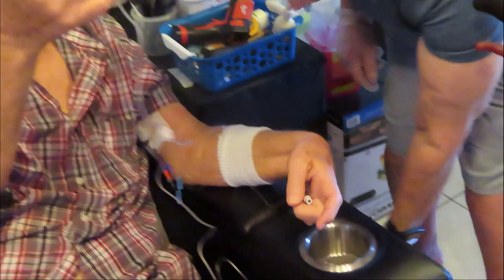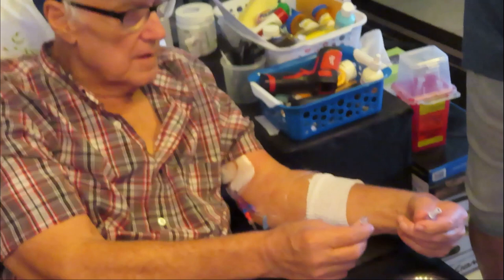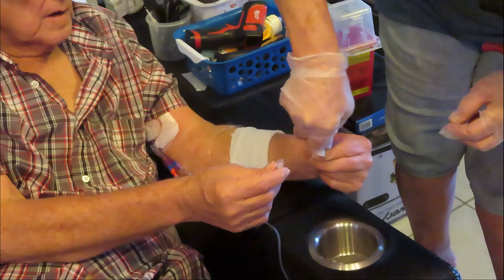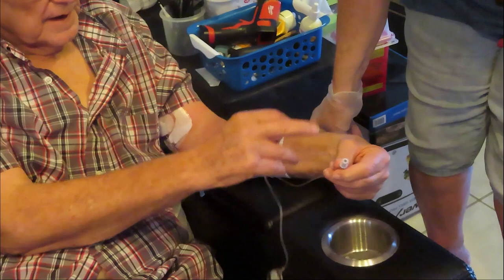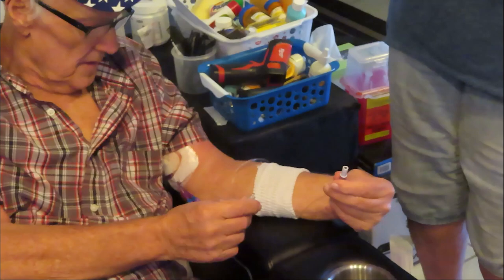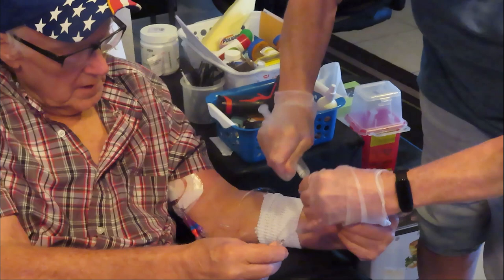Okay, next we're going to clean this again because I contaminated it. I'm going to clean this end again. And now we're going to put the saline into this, which goes up to my PICC line, and flush it out. We always take the air out of it. Which I don't know if Donnie's seen or not. And it's dripping everywhere.